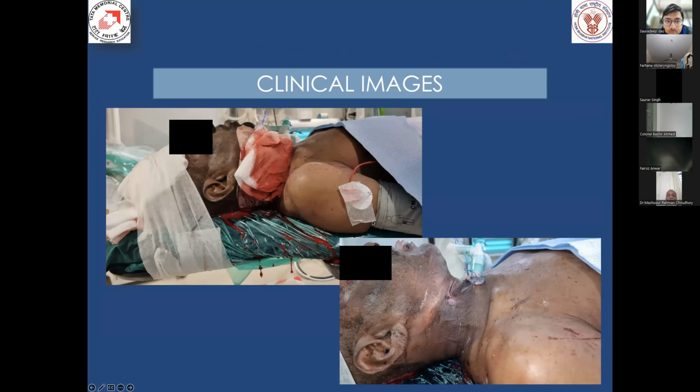At the end, when everything is controlled, you see that the hole is very small, but potentially it could be a life-threatening bleed. In these situations, I think our surgeons would agree, it becomes very difficult. In the post-RT setting, it is like a frozen neck. It's difficult to go in and control the bleeder. So in such situations, the endovascular option would be the best.